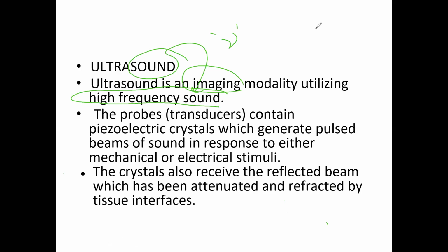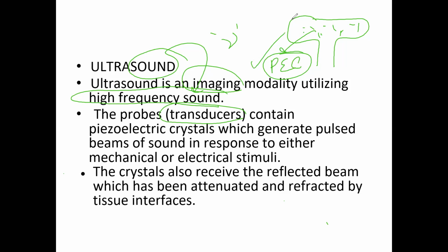The probes that are there, the transducers, contain a lot of piezoelectric crystals. You can say PEC, piezoelectric crystals. They generate beams of sound in response to either mechanical or electrical stimuli.